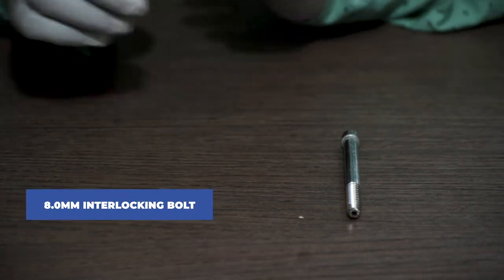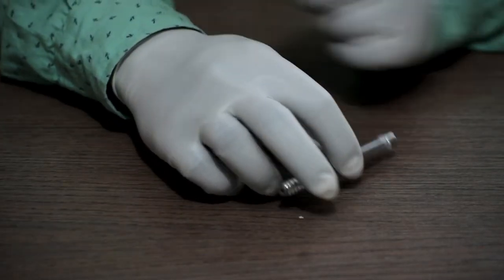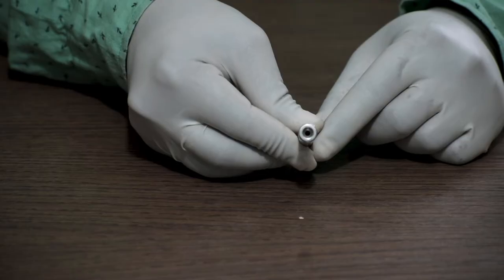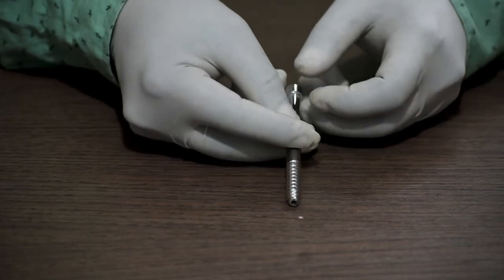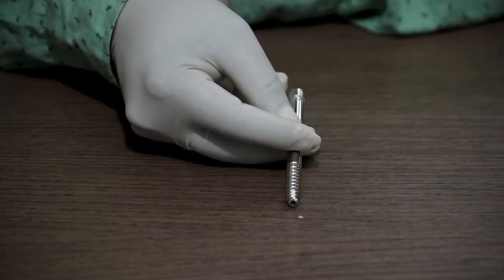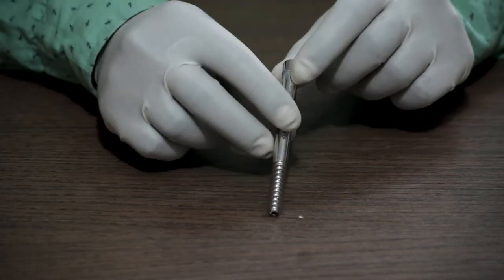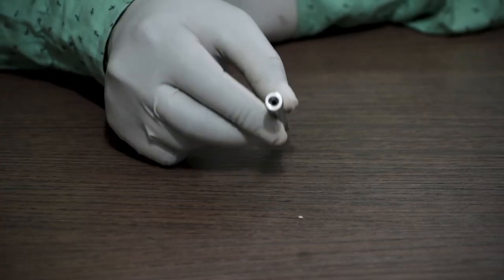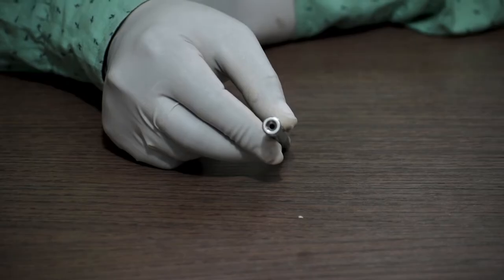Next is 8 mm interlocking bolt. Available in the length of 50 mm to 120 mm, depending upon the company. This is also cannulated and also used to fix the proximal head of the nail.